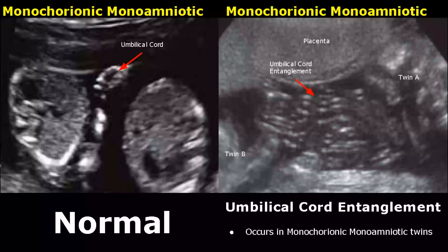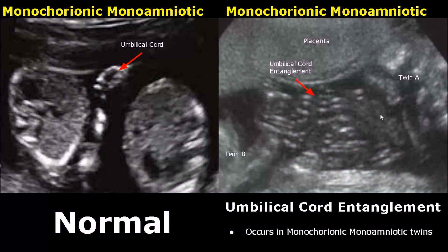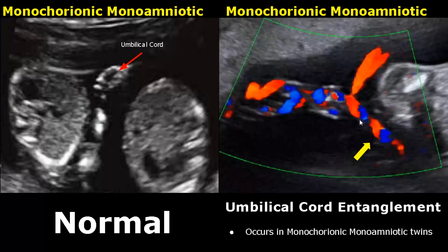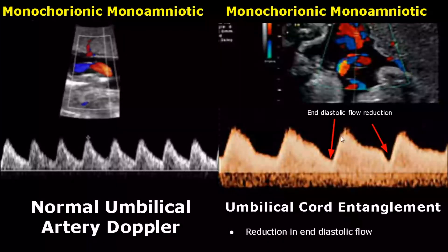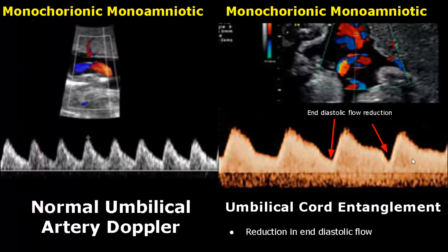Umbilical cord entanglement can occur in monochorionic monoamniotic twins. The cords of both twins form a knot as they entangle. We can confirm umbilical cord entanglement using color Doppler, which clearly shows the entwined umbilical cord. On pulsed wave Doppler, reduction in end diastolic flow is seen, with a notch in the end diastolic waveform.